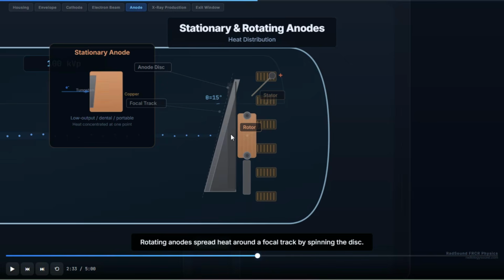The bearings must withstand very extreme heat at a high speed of rotation. As we mentioned, the rotating anode can rotate up to 3,600, and on modern machines up to 10,000 revolutions per minute (RPM).